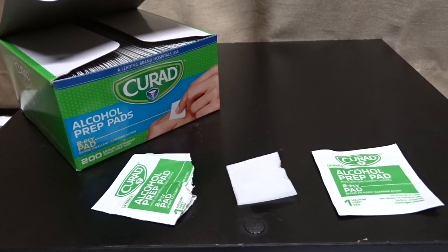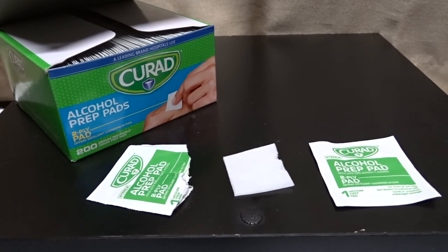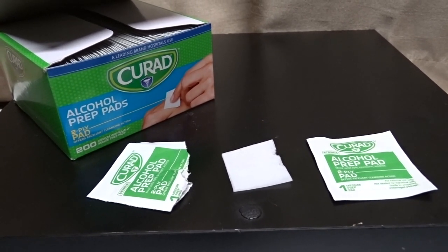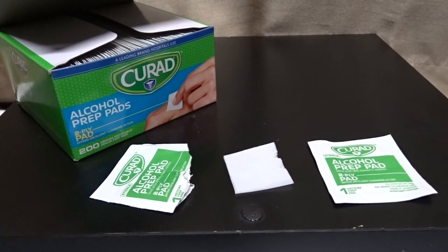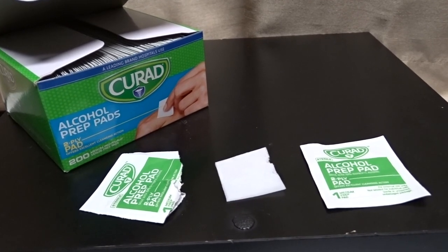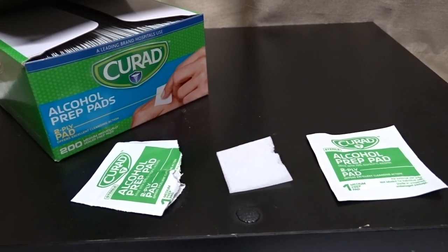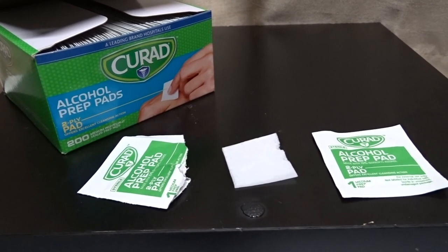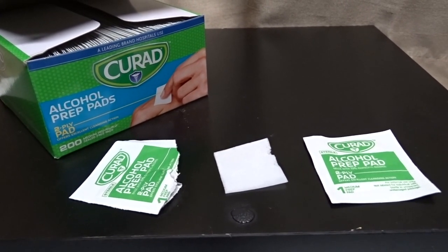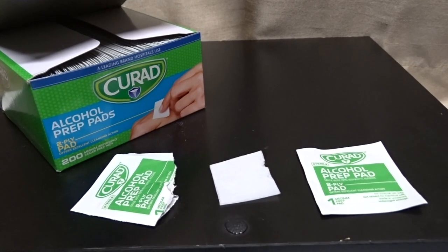I've worked in the lab for a while and we have to use these quite often because we extract blood from people using needles. It's really necessary to have a good alcohol swab to clean the area — you don't want any infection to happen. We swear by Curad for our patients; it's really important to choose a good swab so nobody comes back saying you caused an infection. These work very well and I'll continue to use them.